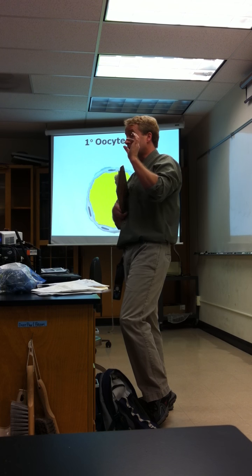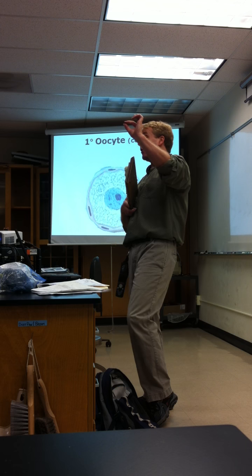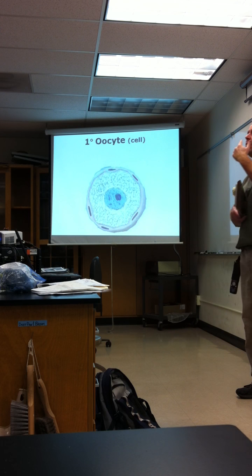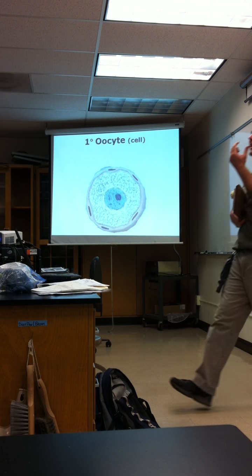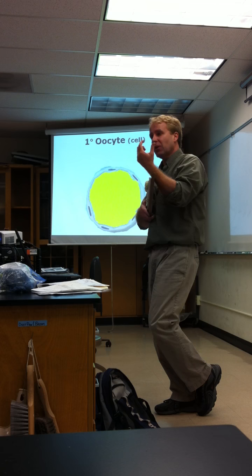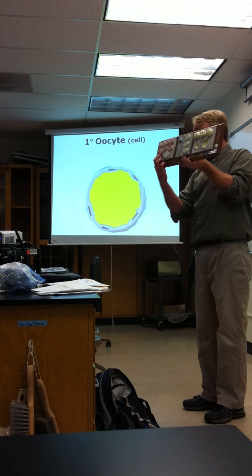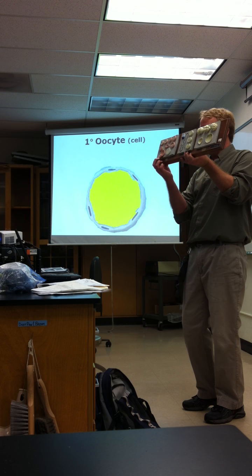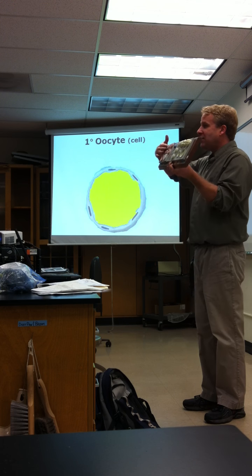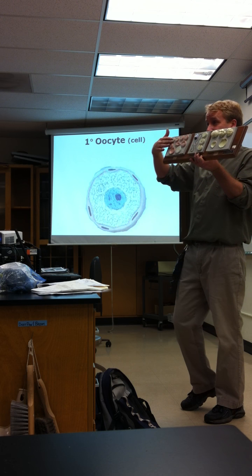As far as the histology is concerned, the place where the primary oocyte becomes secondary oocyte, like I mentioned in lecture, is in which follicle? The mature follicle. This follicle right here, the mature follicle, is where the primary oocyte becomes the secondary oocyte. But that means that all of these oocytes are primary oocytes paused in prophase 1.